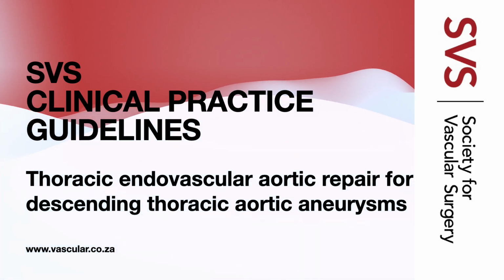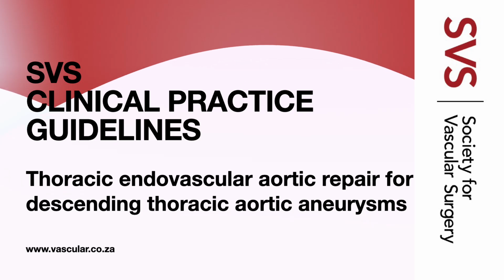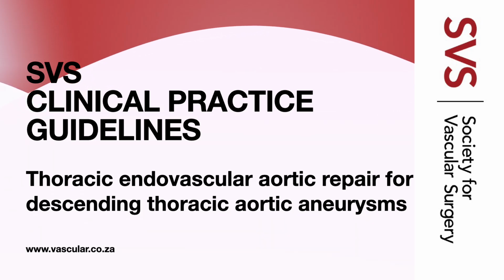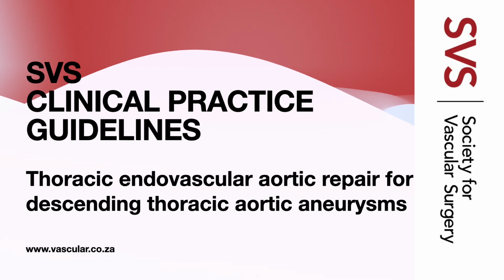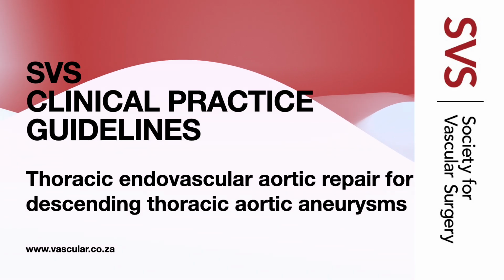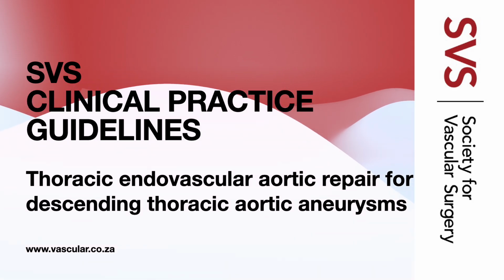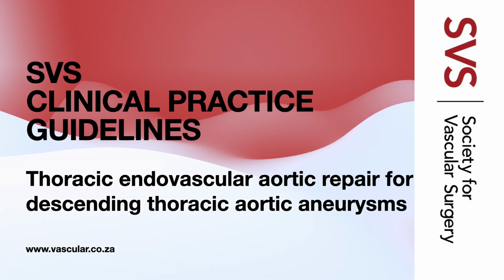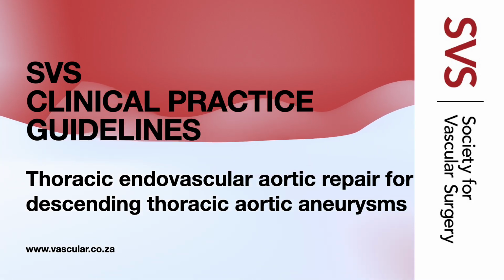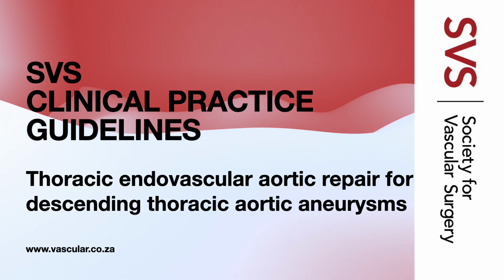It often is. The sources we looked at show that, compared to the traditional open surgery, TEVAR usually means much lower rates of complications, shorter hospital stays. Which is huge. It really is. And better short-term survival rates, too. Shorter stays mean faster recovery, getting back home sooner. So yeah, for many patients, TEVAR is now the preferred way to go.